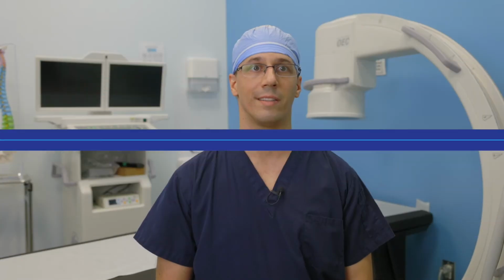Number 1, the same specialized mobile C-arm X-ray machine is used to guide needles to each joint. The patient will have their skin and soft tissues frozen with local anesthetic first before the radiofrequency needles go in. That way, they are comfortable. Number 2, once the needles are in, a radiofrequency wire is inserted into each RFA needle, with the back end attached to the RFA machine.